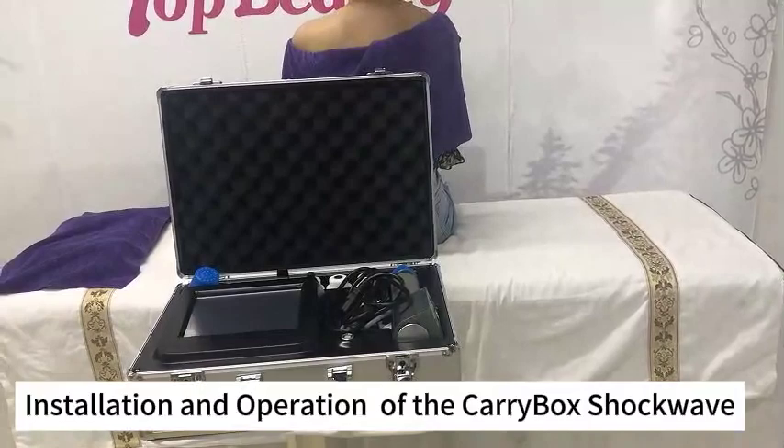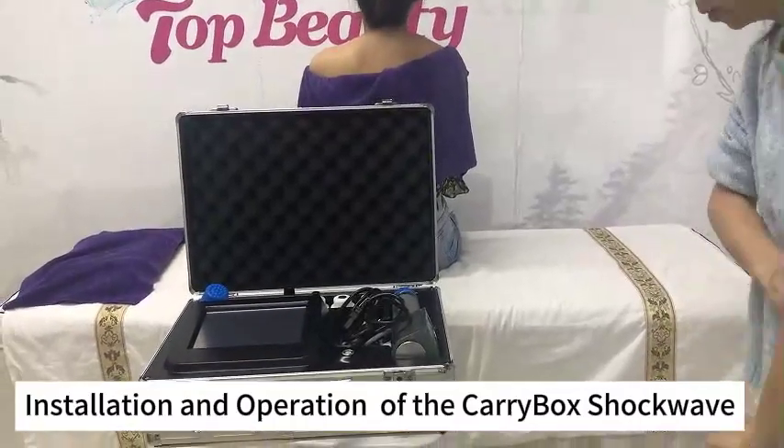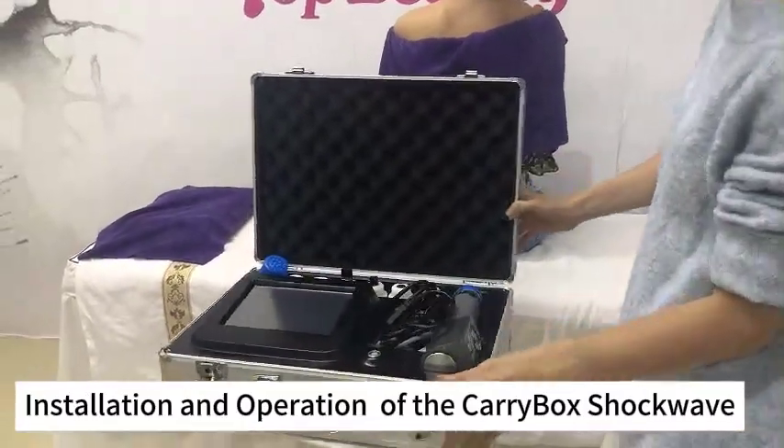Hello, this is Top Beauty. Now I will introduce the carry box shopping machine for you. Now I will show you how to install the machine.